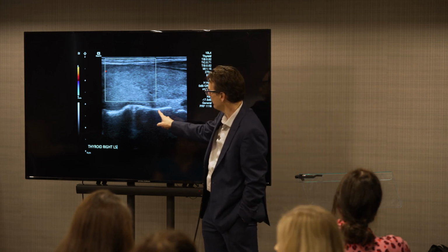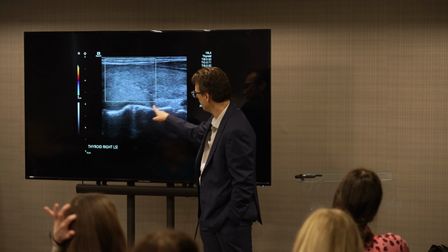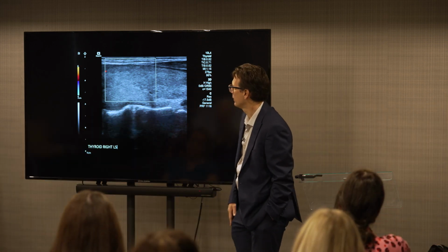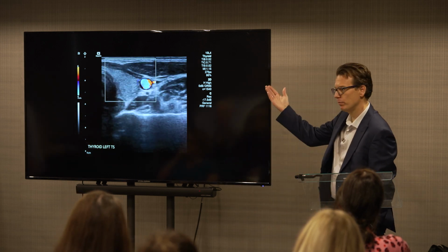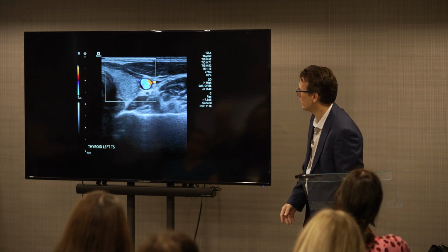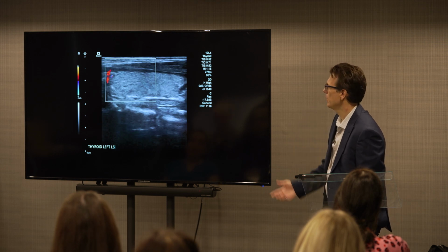You can also see them quite nicely, intervertebral discs, especially if they're young patients, and then these are individual vertebral bodies that you can see here. Okay. Next slide. And again, once you've done the right side, you do the other side. So, same thing. Okay, next slide.